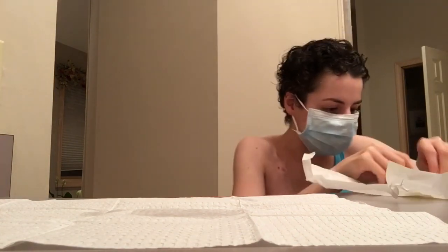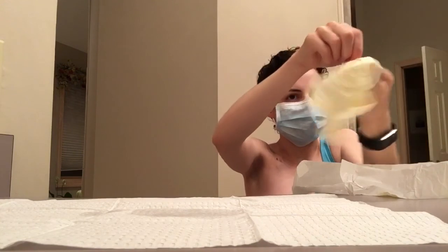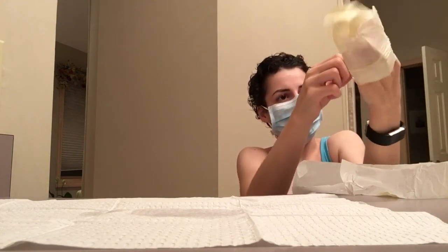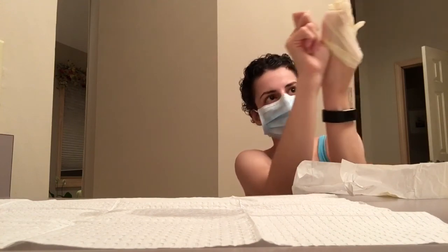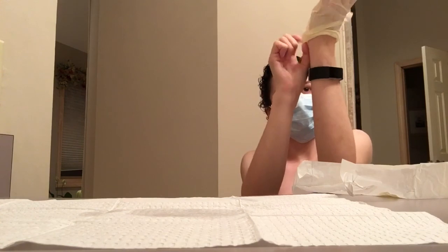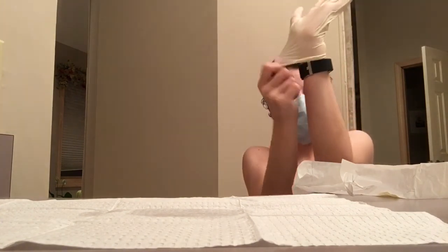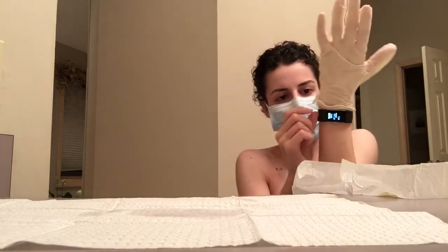So I'm only touching the outside of this pair of gloves because the cuff is going to be turned inside out, and then that'll be the inside. Oops, and then you have two fingers in, so I'm just putting my hand in the glove because I don't want to be touching the outside. And then when I flip it over, I'm putting my hands all on the inside.